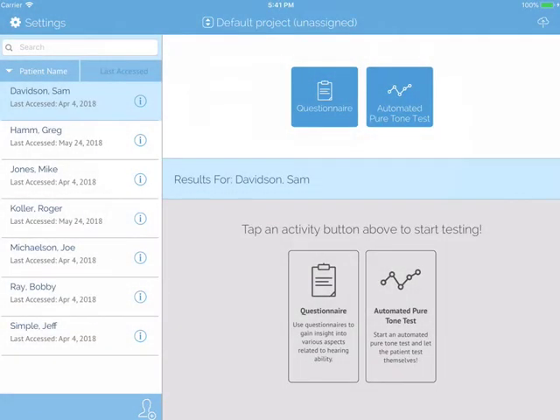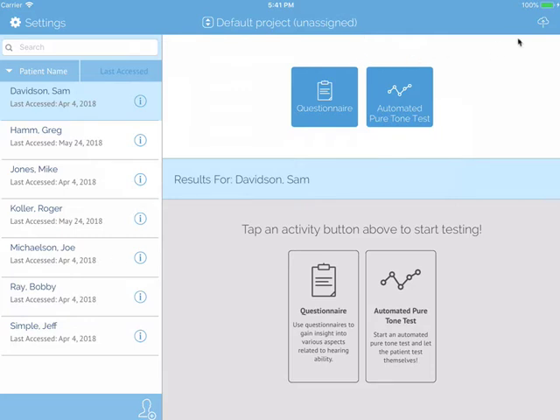At the top of the screen on the left side, you will see the settings button. Also at the top, but in the middle, you will see and be able to select any project that you have created by using the arrows. At the top on the right, you will see a cloud icon.